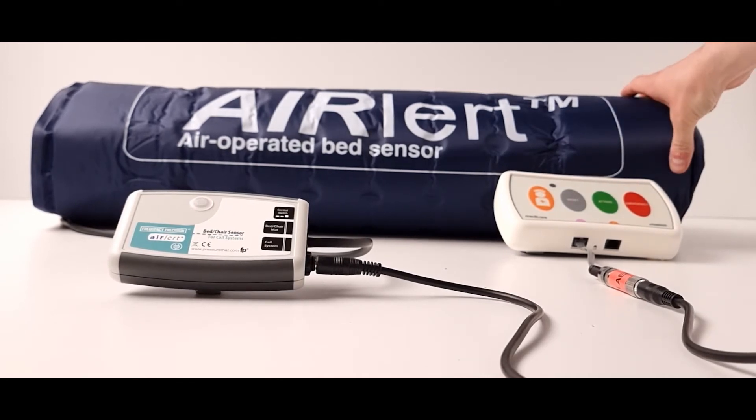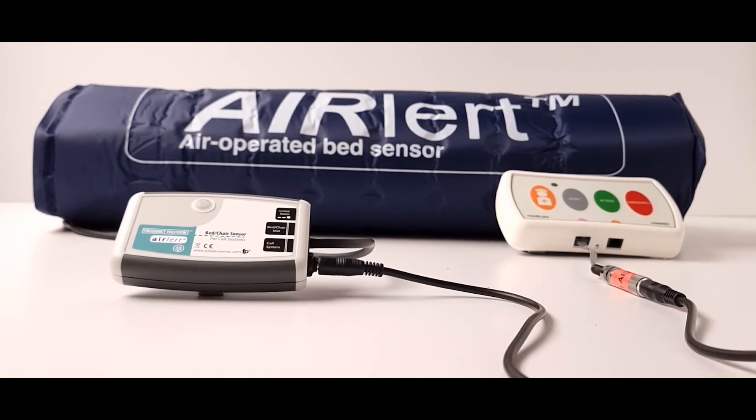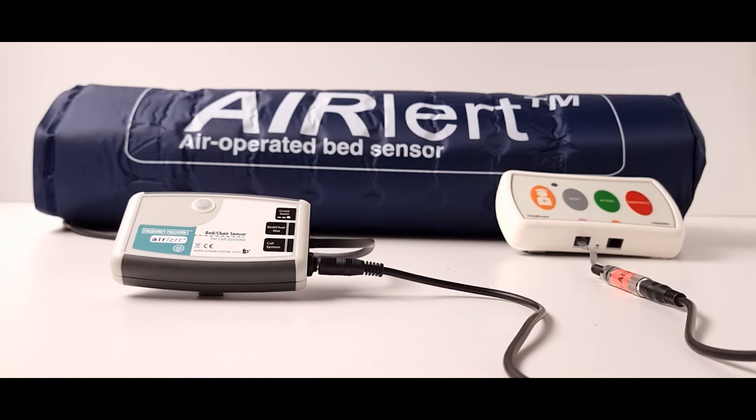The sensor mat can be used on any bed type including underneath airflow pressure relieving mattresses and the control box is compatible with almost any nurse call system.